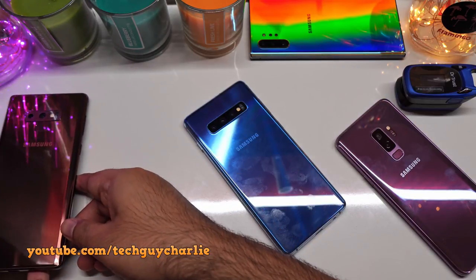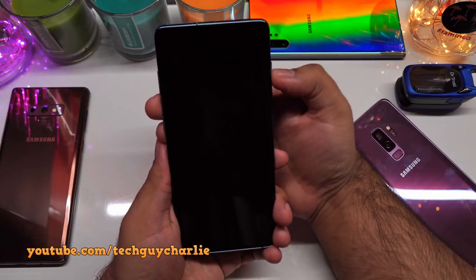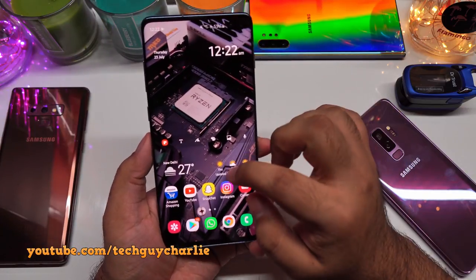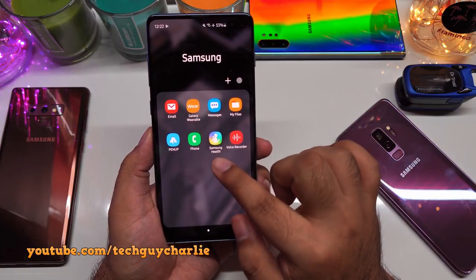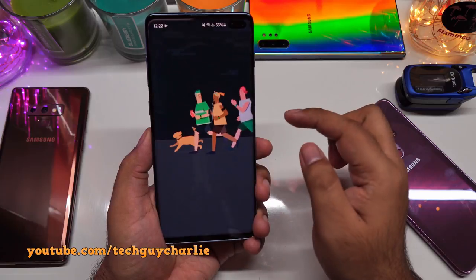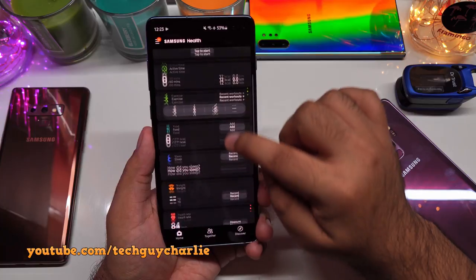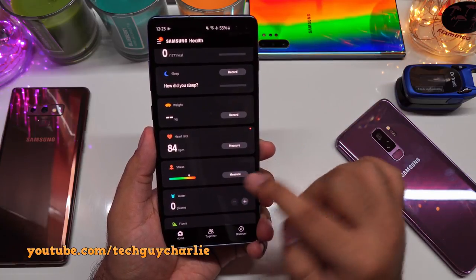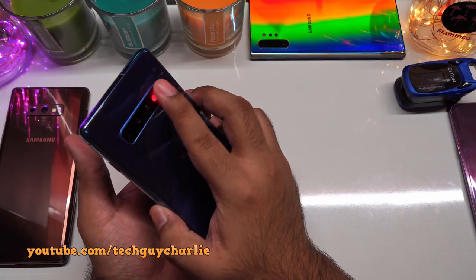Let me show you how to measure your oxygen saturation level on the Galaxy S10. Open the menu and go to Samsung Health, then open the app and go through the initial setup. Scroll down to the section that says Stress and tap on Measure.